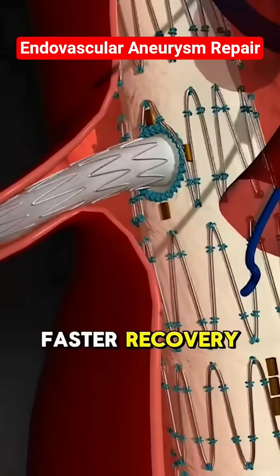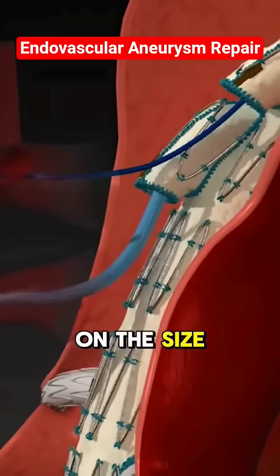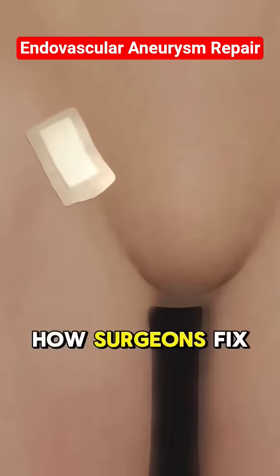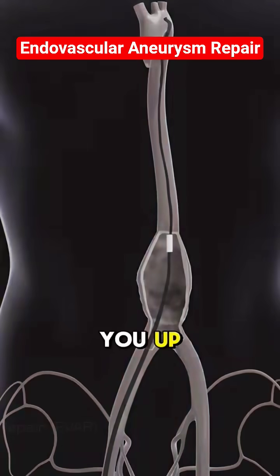EVAR has a faster recovery, but not everyone's a candidate. The choice depends on the size, shape, and location of the aneurysm. Now you know how surgeons fix a ticking time bomb in your belly and save lives without even opening you up.